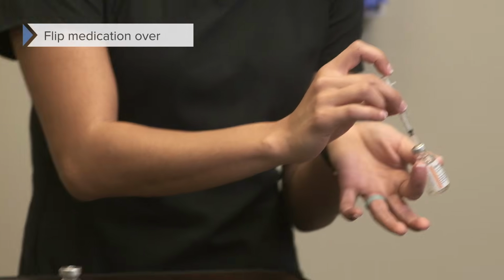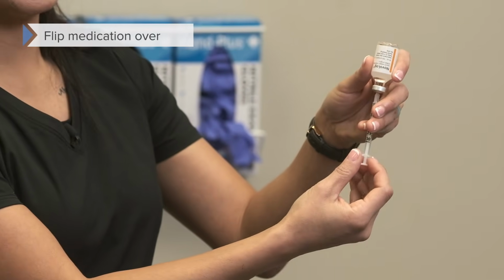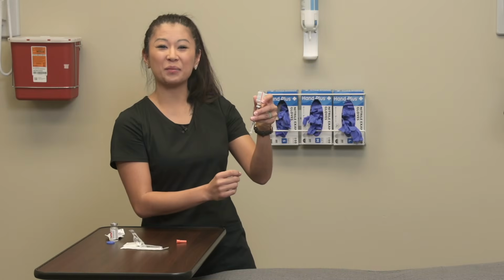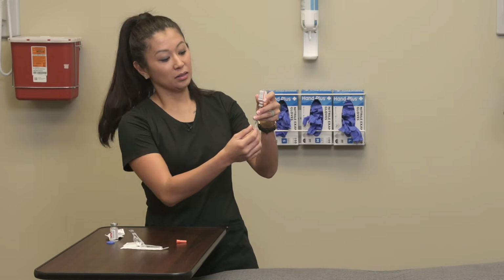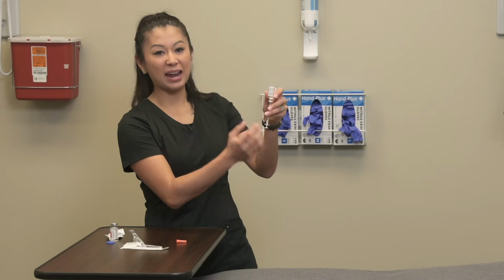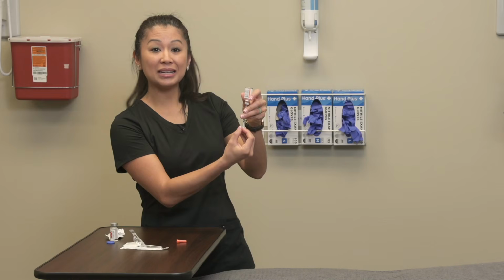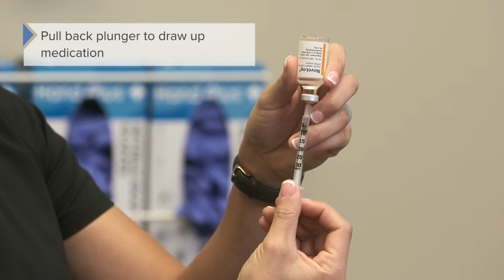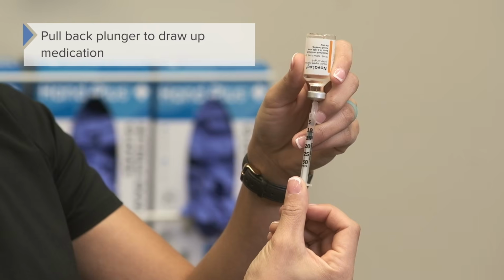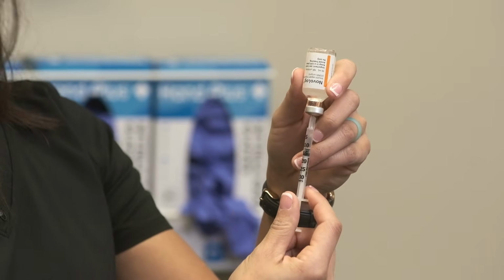So now I'm going to take this hand and flip this over. I'm going to pull up 5 units, and units because I'm using an insulin syringe, and insulin is typically in units. Now I'm going to take this, and notice that I have to kind of use both hands. There's a little bit of dexterity here. I'm going to take the plunger and slowly pull back this insulin amount, and you can see it fill up the top.